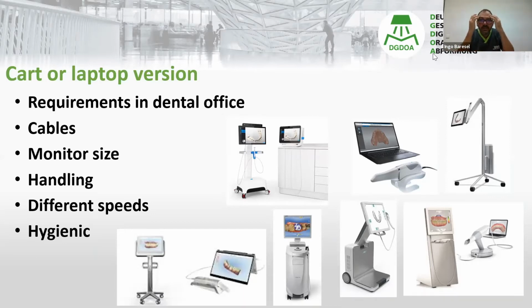So imagine you have a scanner, you have a power supply, you have a laptop, and so on. So think about what I said. We are sitting behind the patient while scanning. Where do you put the laptop? On the patient? Should the patient keep the laptop holding? This is not possible. And you have so many cables and so on, and you have to grab them all and carry them to the next room. This is not helpful.